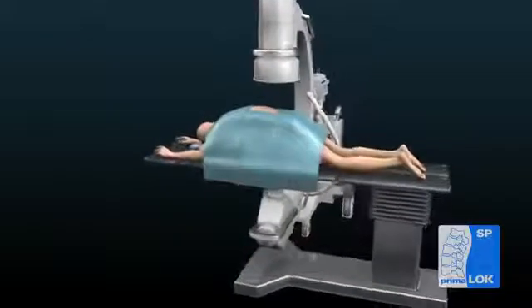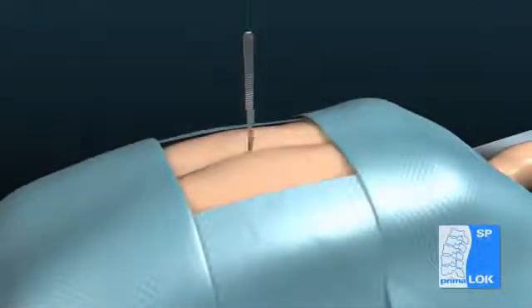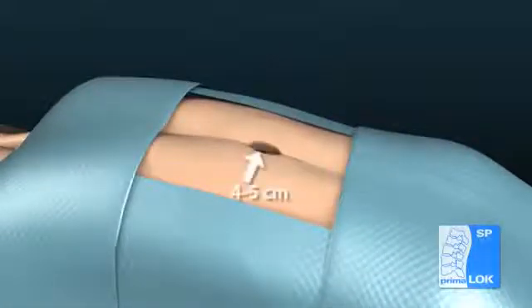With the patient prone, identify the operative level through palpation and intraoperative fluoroscopy. Make a 4 to 5 centimeter midline incision and elevate the perispinous musculature, exposing the spinous processes and lamina.